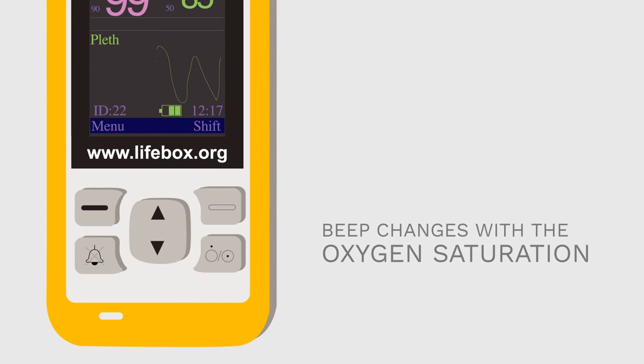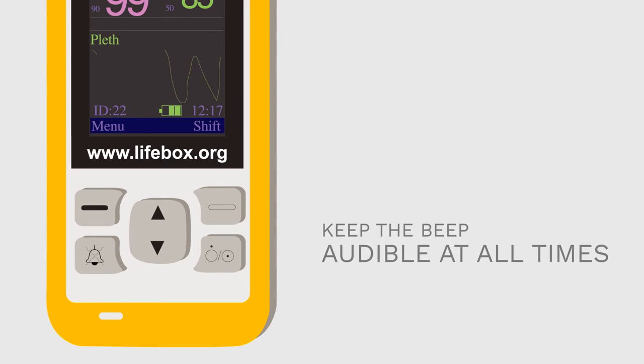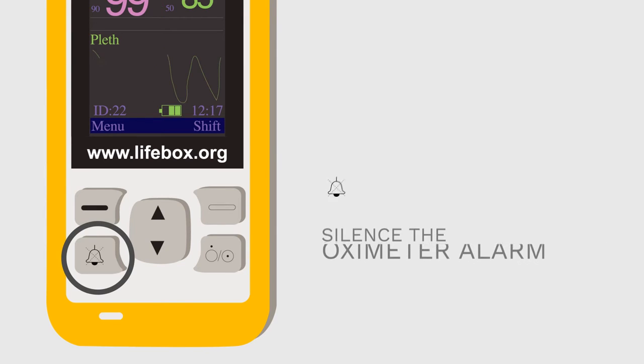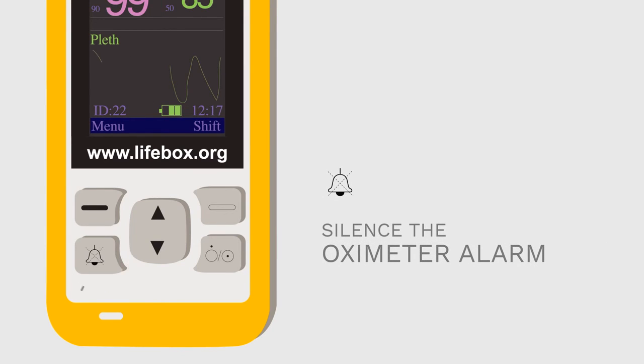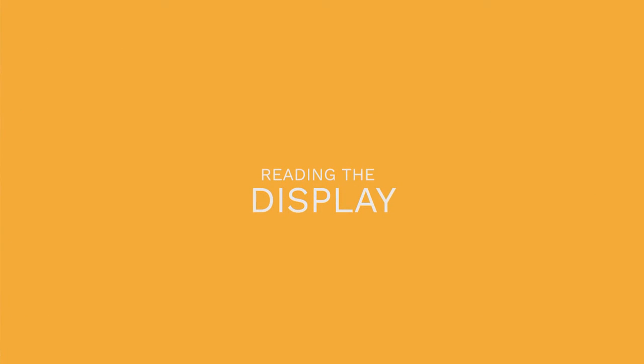The beep of the oximeter changes with the oxygen saturation. This is a second set of eyes and ears in your operating room, and we recommend that you keep the beep of the oximeter audible at all times. Below the menu is a button that can silence the oximeter alarm, but only for 120 seconds. The alarm goes off whenever the SpO2 or pulse rate falls below the range you have set, unless the device has been silenced. Let's turn our attention to the display.